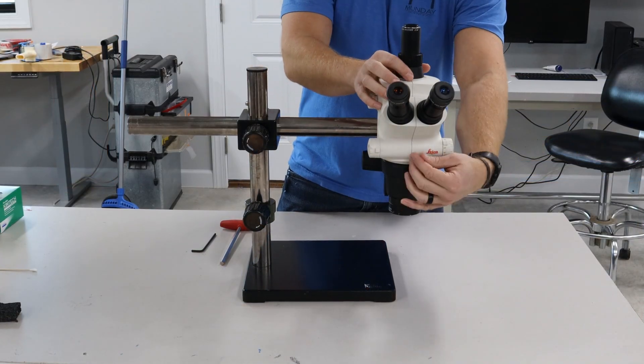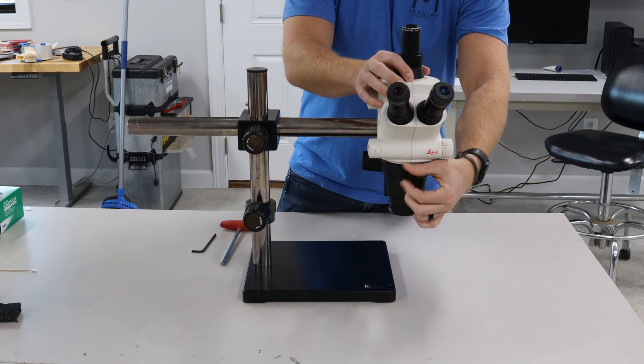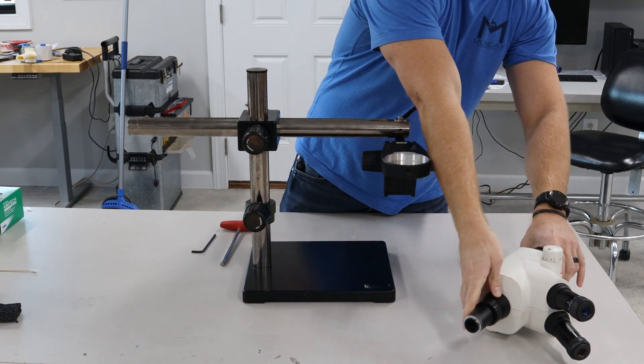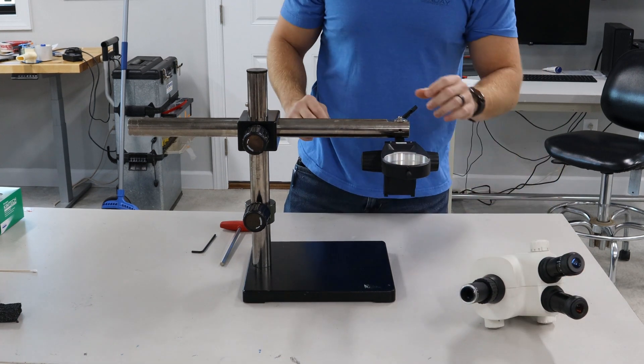The first and most important thing is to remove the pod. There's gonna be a thumb screw right here and we're gonna take that out and set it to the side somewhere nice and safe so it doesn't tilt over.